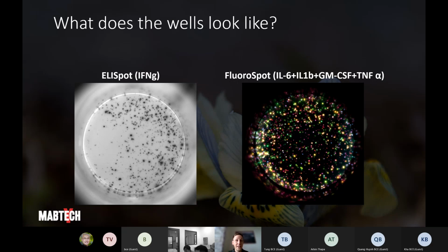If you have an individual that has been infected with COVID-19, then the cells you have added from that person are going to be activated, because they were activated in the person's immune system. So that is going to be a confirmation: if you have a lot of spots being generated upon that stimulation, you actually have an individual that has been infected with COVID-19, and so on.